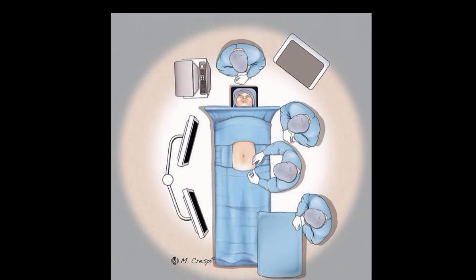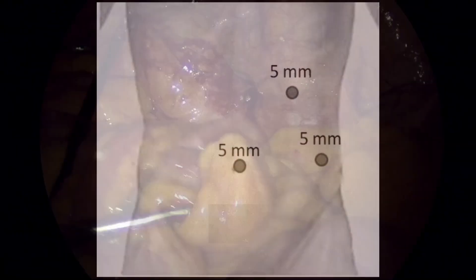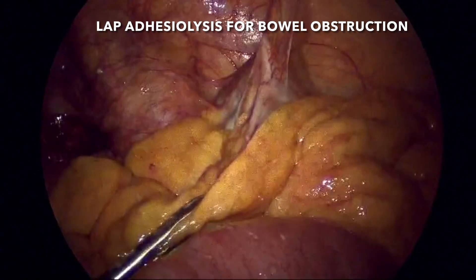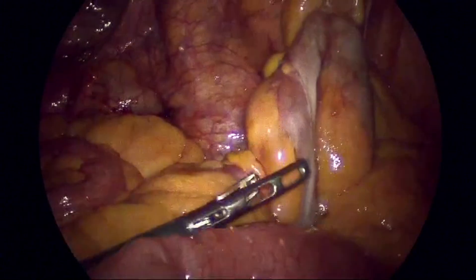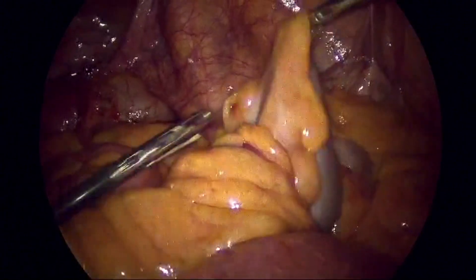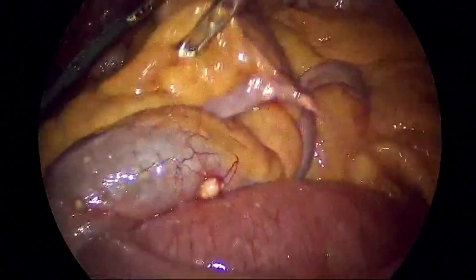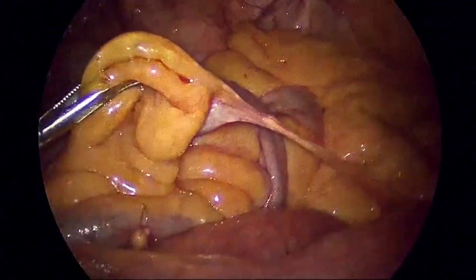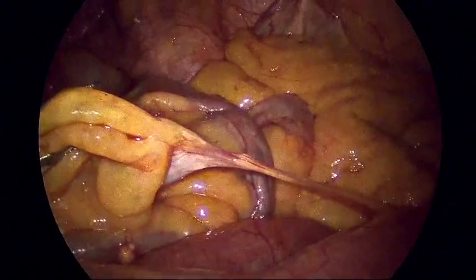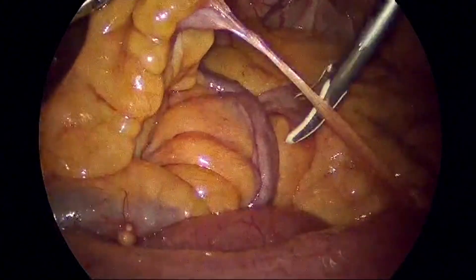The patient is in supine position. We did a 3-port diagnostic laparoscopy with 5 mm ports. This is the ileocecal junction. We should try not to hold the bowel directly; instead, hold the fat surrounding it. Here is the first band, which was going from the ileum to the area of the colon.